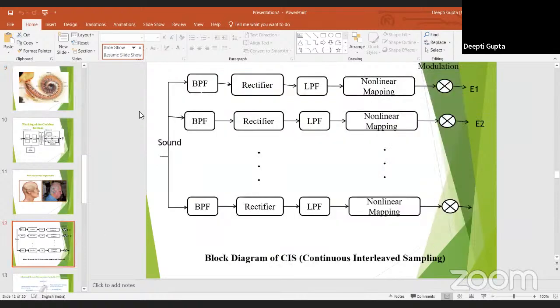We are dividing it. So we are applying some filters so that we can remove some sounds having a fixed frequency range. So we are applying some filters also, so we can remove that fixed noise. And after that, we are calculating the features. As I have told you, whatever sound it takes from the microphone, it calculates the features of the sound. Features, or here we can say the rectifier and low pass filtering. We are calculating the envelope of the sound.